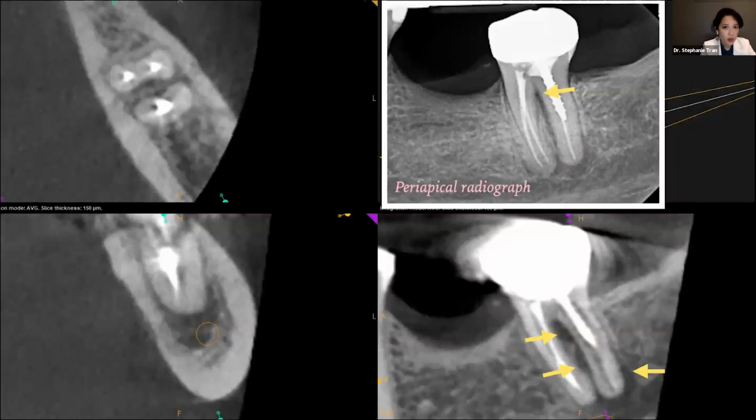This didn't confirm a vertical root fracture because I didn't see any severe bone loss up one side of the tooth. The furcation bone loss didn't extend all the way to the apex, so that didn't tell me that there was some sort of root fracture. And the periapical radiolucency was fairly centered around the apex itself. The root canal filling material was pretty centered in the mesial, didn't involve the sides of the root, and the post itself didn't go completely bust through the root, so it looked like it was doing okay. The main issue with the distal was that the root canal filling material was slightly off-centered, so that looked like it wasn't a full missed canal in the distal, but it was missed anatomy, like a fin or the other side of an oval-shaped canal. So if part of a canal is not treated, it can still harbor a lot of debris and bacteria.